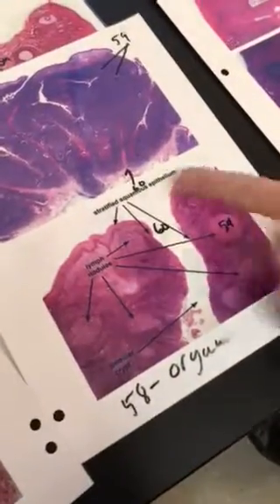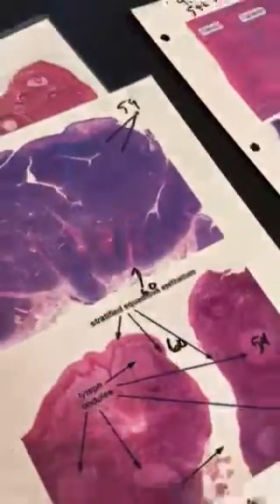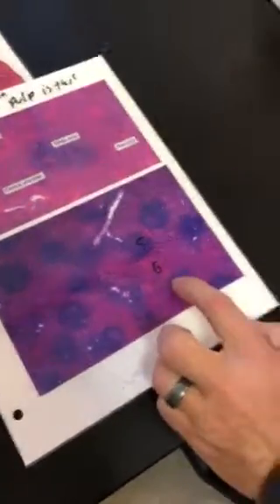These are tonsils. You just have to know the organ. It's a tonsil. You can tell it's a tonsil because it has crypts and lymph nodules. This is a spleen. You just have to know it's a spleen. It has white pulp, which is nodules, and red pulp.